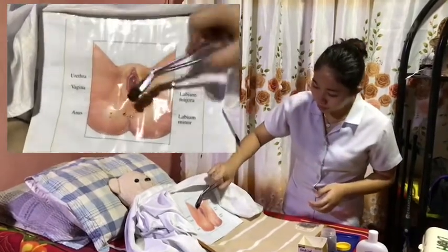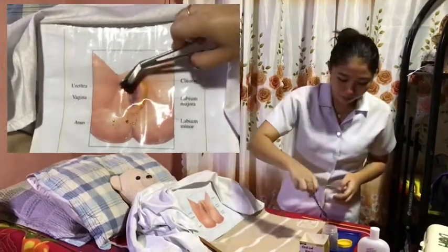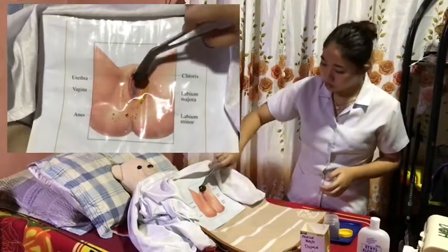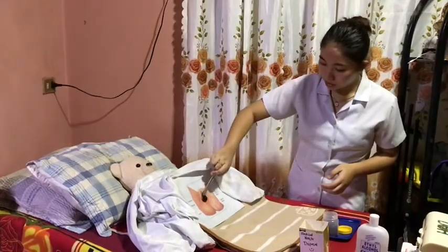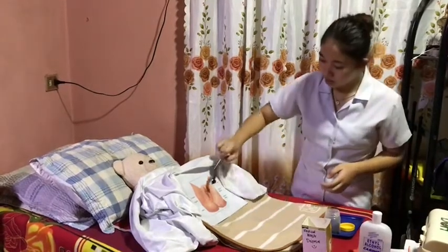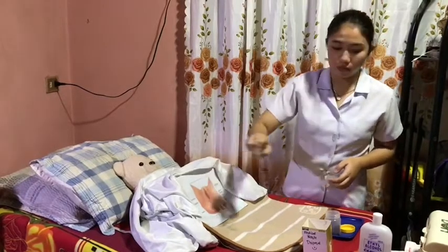Now I'm going to clean the labia majora. Okay. Now the labia minora. And lastly, to one side of the labia minora.